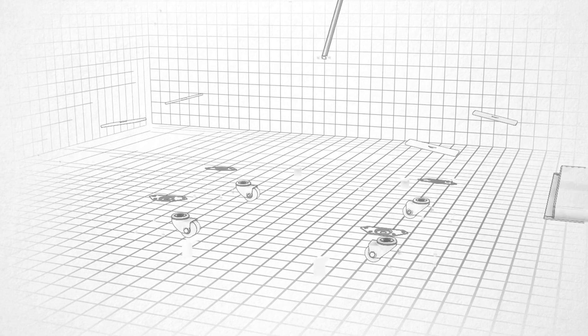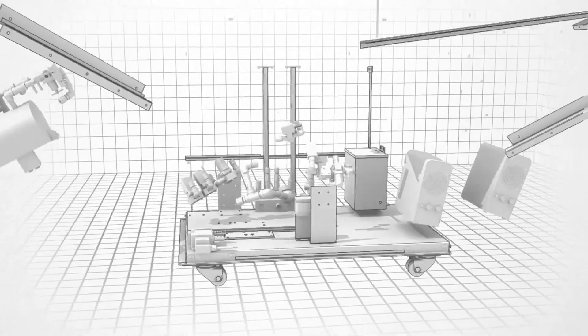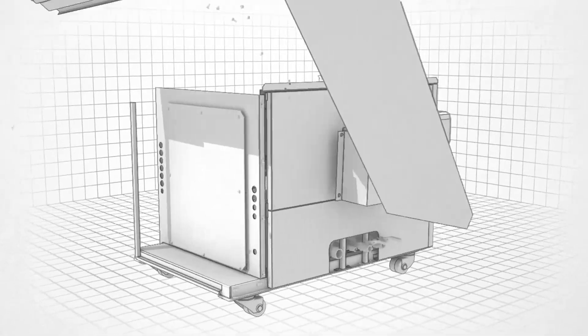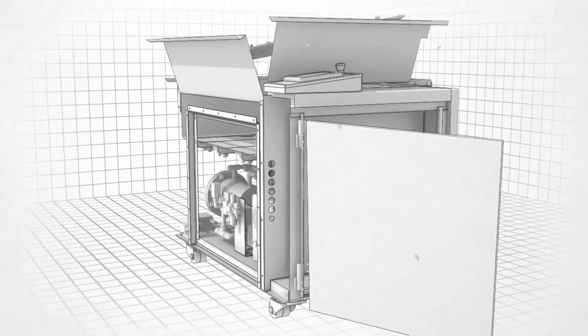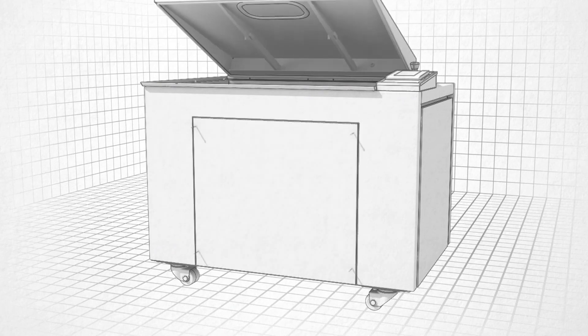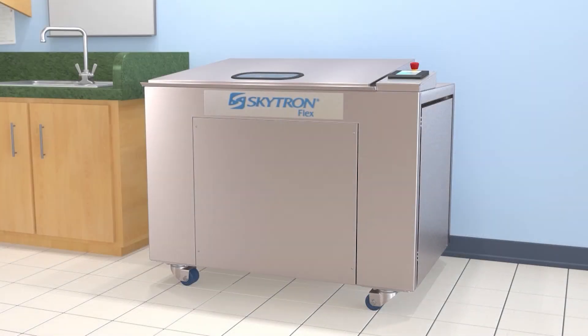Built with a level of engineering inspired by the automotive industry, the Flex from Skytron offers an alternative. Through an automated multi-purpose washing approach, surgical instruments are cleaned completely both inside and out.